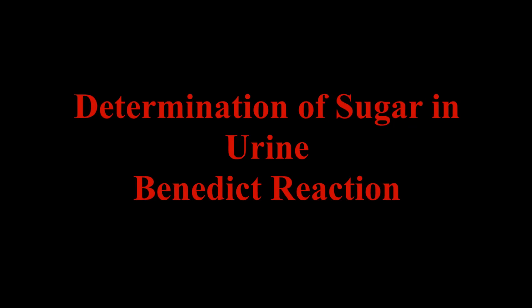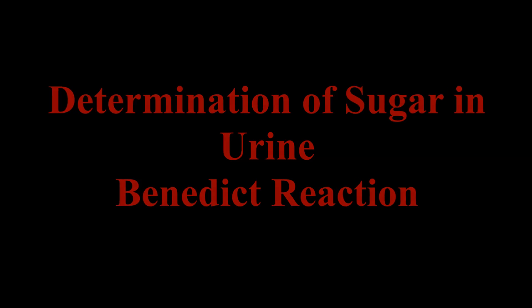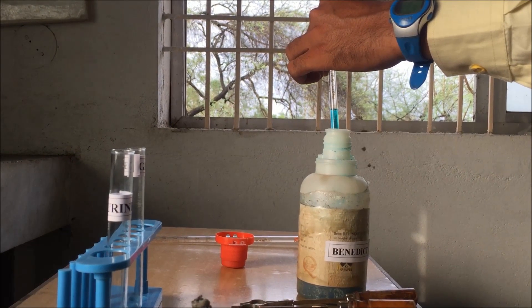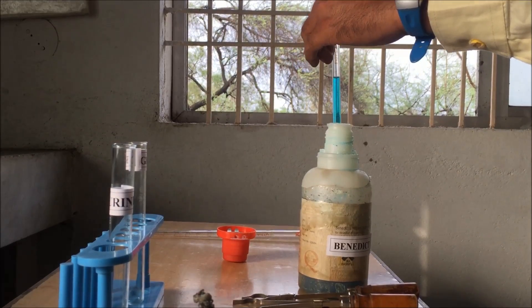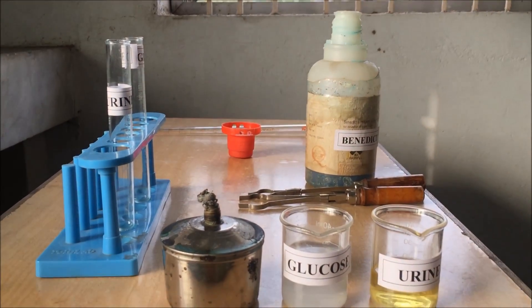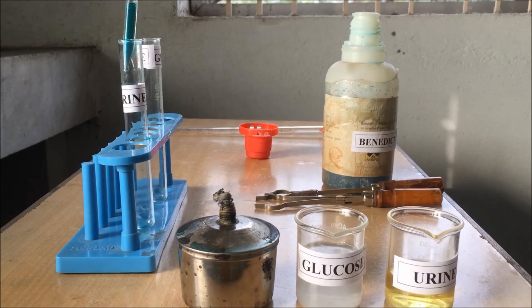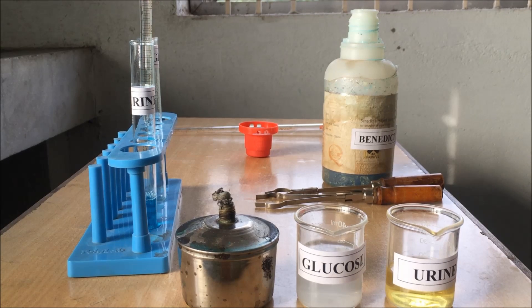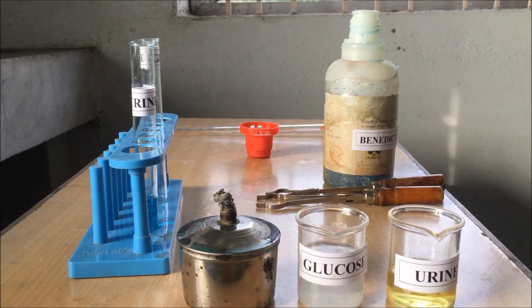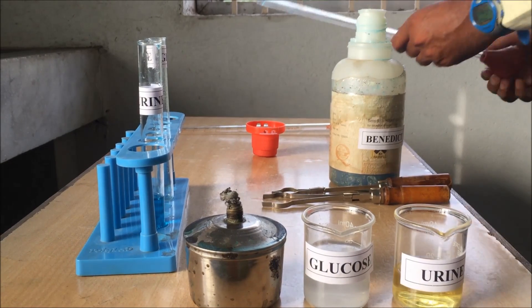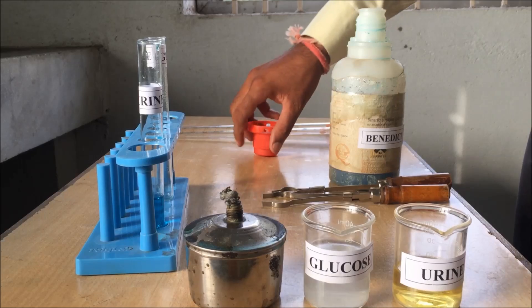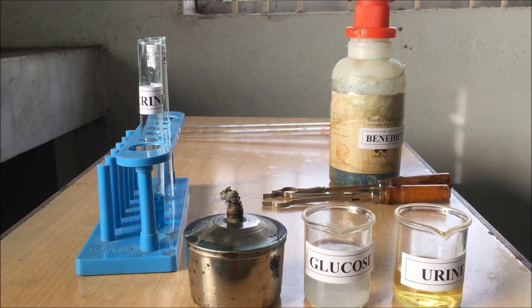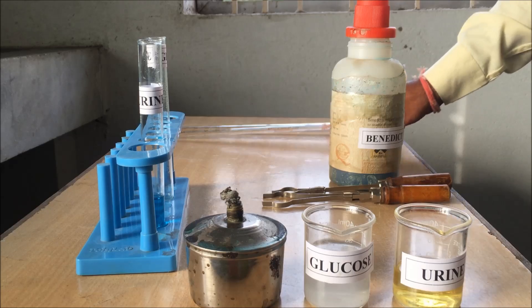Today we will determine the sugar contained in urine by using the Benedict reaction. To perform this experiment, pipette out 5 ml of Benedict reagent from the Benedict bottle and slowly transfer it into one of the test tubes. We have taken two test tubes — one for urine analysis and one for glucose analysis. After transferring the Benedict reagent, close the container tightly with its cap to avoid any spillage due to accidental events.